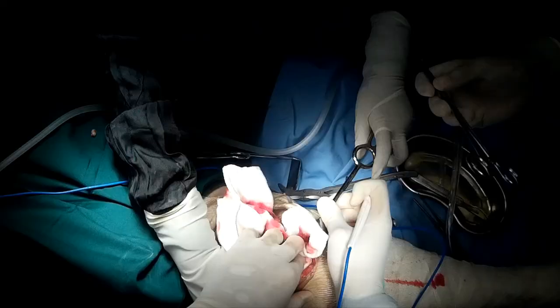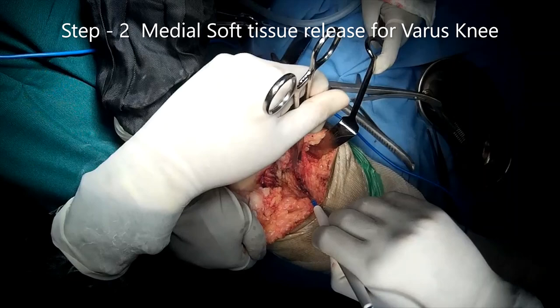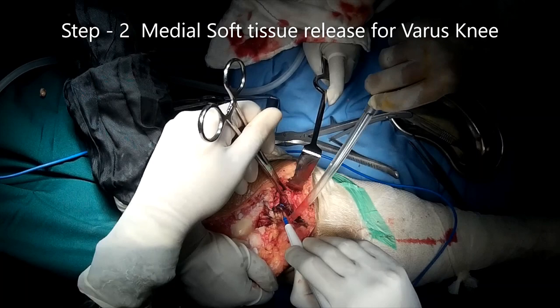Knee replacement fundamentally is a soft tissue balancing surgery, which means that we are trying to balance the soft tissues on each side of knee joint so that they are in equal amount of tension.